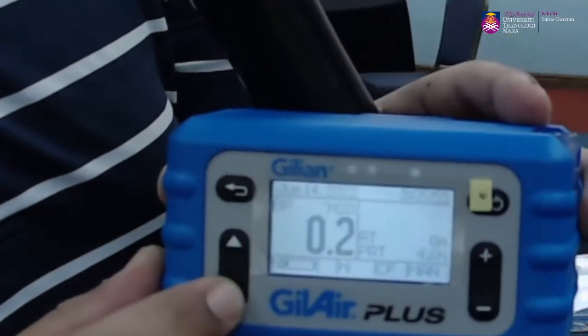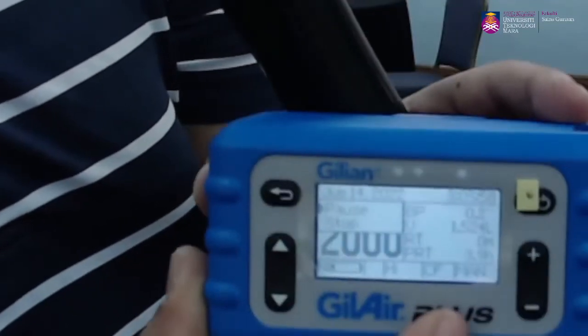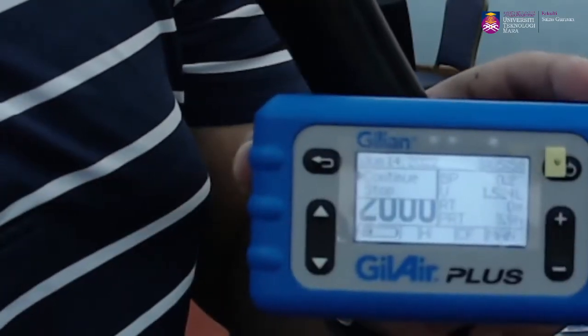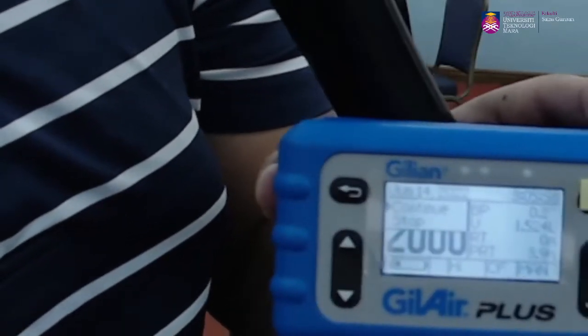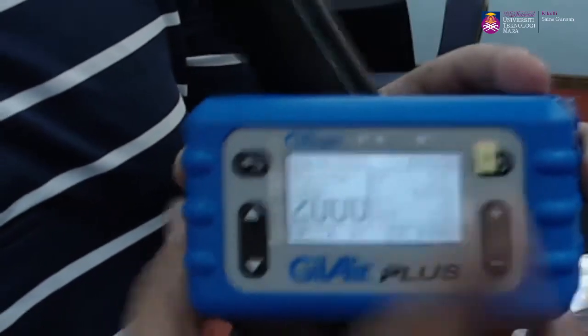So usually-nya kalau kita nak stop, kita just tekan enter button yang sama. So kita boleh ada option pause ataupun stop. So kalau kita nak pause, kita just tekan pause. And kita boleh continue balik with the same flow rate ataupun setting. And then based on runtime tu dia akan continue daripada kita start tadi. Okay, contohnya kalau kita nak stop, kita just scroll ke bawah, tekan stop.